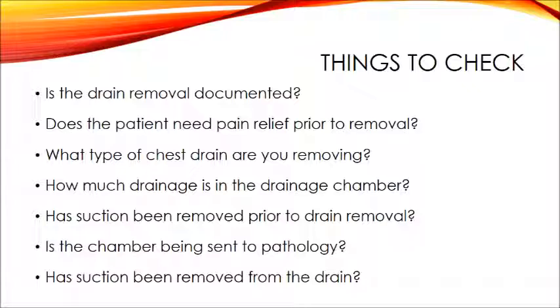Before you remove the chest drain, there's a few things that you need to check. Firstly, you need to check that you have a documented medical request for the drain's removal. Check the amount of drainage in the drainage chamber. Check if the chamber is to be sent to pathology for testing. And lastly, check that suction has been removed from the drainage circuit.